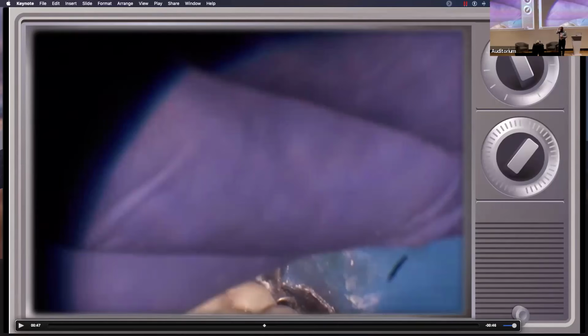So I'm going to say it's a smooth move in, but it's not all the way down unless you just get lucky where it just kind of went down. So if it goes down some, a little bit, if I'm worried about it, I'll take it out and look at it. I'll shake the file off a little bit, put it back in the canal and let it go down and cut to length. But it's not a peck type of motion.